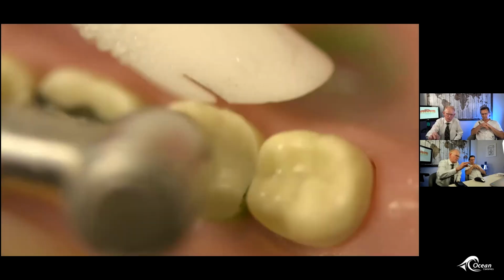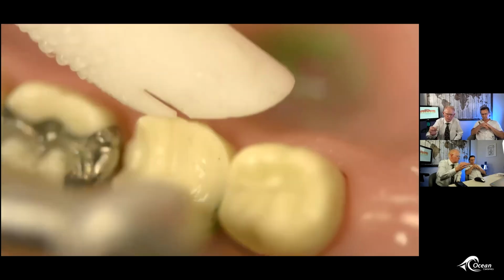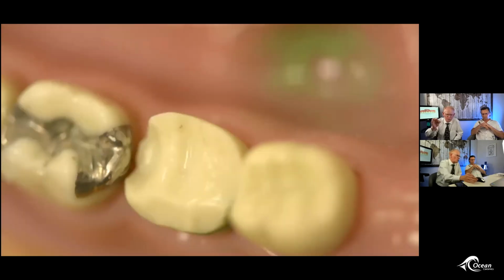So we've done some depth preparation with just a regular 330 burr or something to make sure that we've got our 1.5 millimeters. And what I'd like to show you here, we're going to take a pencil at the end of this and just join the tips of the cusps. And then we find we've got room to develop the cusp on this. This is not just a flat table that we're putting this on. We're taking time to make sure that James can put the anatomy back on there, that it fits, and that it's got enough support underneath it to work.